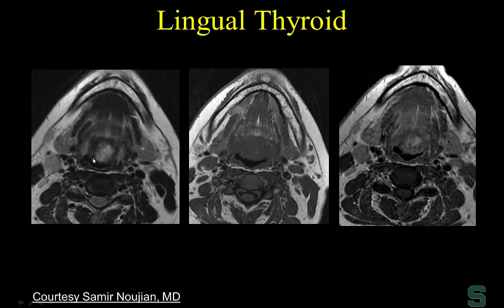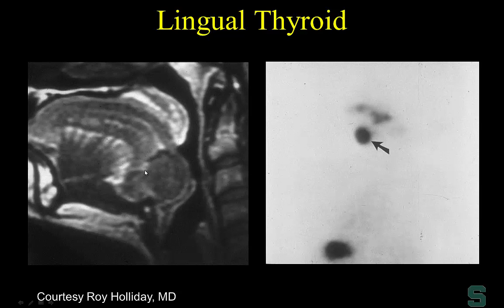Another example on T2-weighted, non-contrast T1, and contrast-enhanced T1 MR — it looks just like squamous cell carcinoma. But if the patient is hypothyroid, consider lingual thyroid tissue. The tip-off is the location. On sagittal T1-weighted image, lingual thyroid tissue is nicely shown. If uncertain, perform a nuclear medicine study — in this case, the pertechnetate uptake corresponds with the abnormality seen on non-contrast T1-weighted MR.